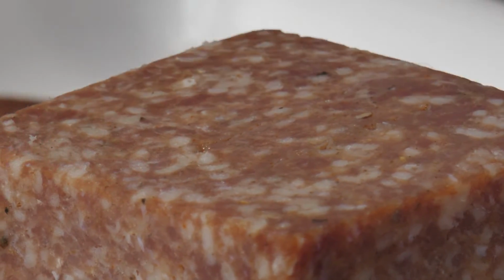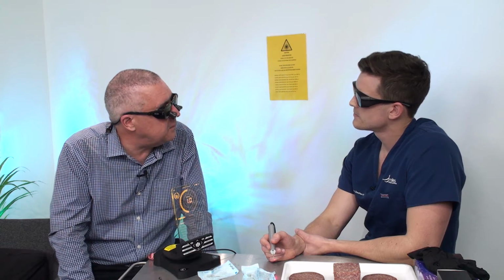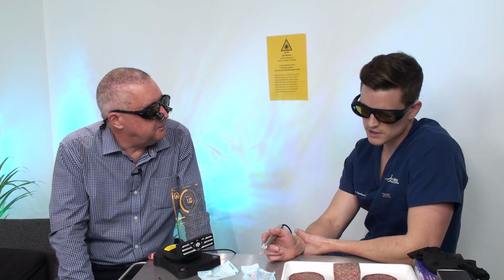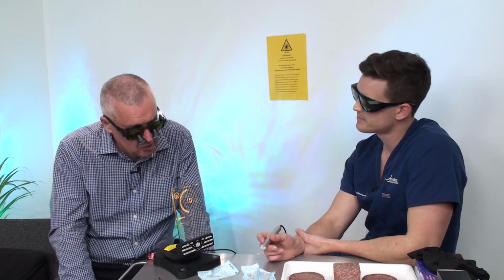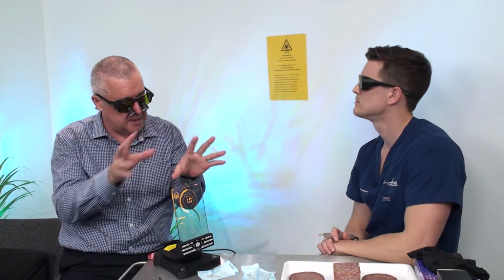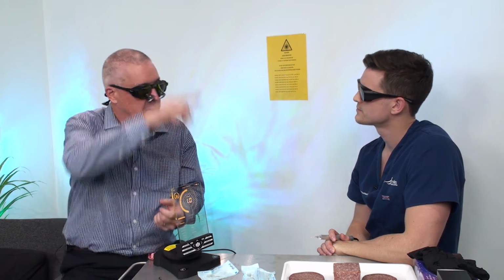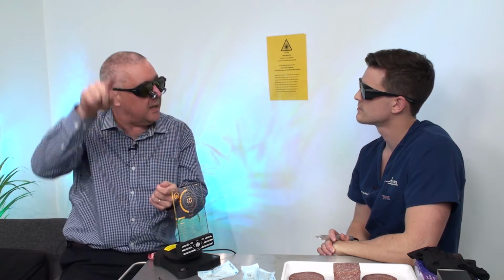And I'm sure in your practice you worked out pretty quickly, if you're going to be cutting gingival tissue, you're going to go for the double. Yeah, definitely. So I'd usually keep it on the dual wavelength for that. That's right. So what's really neat is because the two lasers have actually been synchronized, those two peaks line up. So that gives a peak power of about 20 watts. But it actually goes like a triangle up and down as it oscillates, which is really useful.